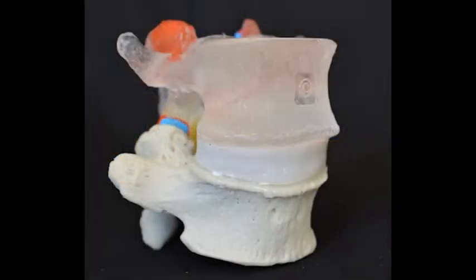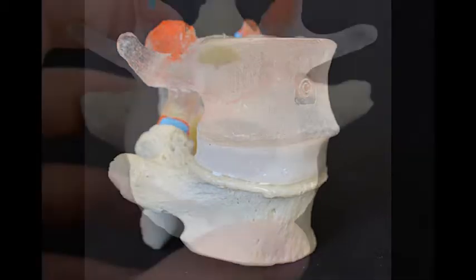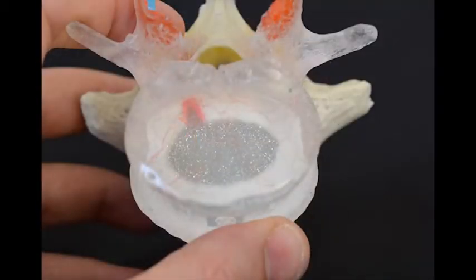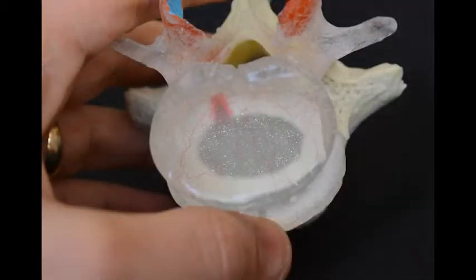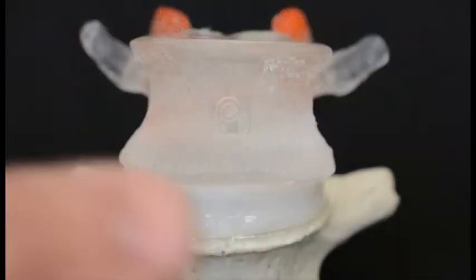Triple D introduces the first hypermobility lumbar model constructed with a two-part disc and a reflective three-dimensional nucleus pulposus.